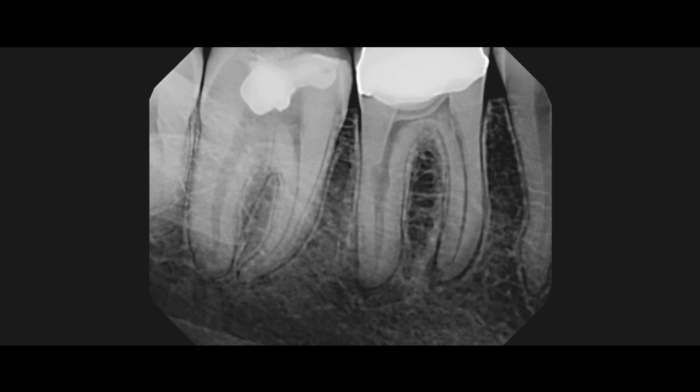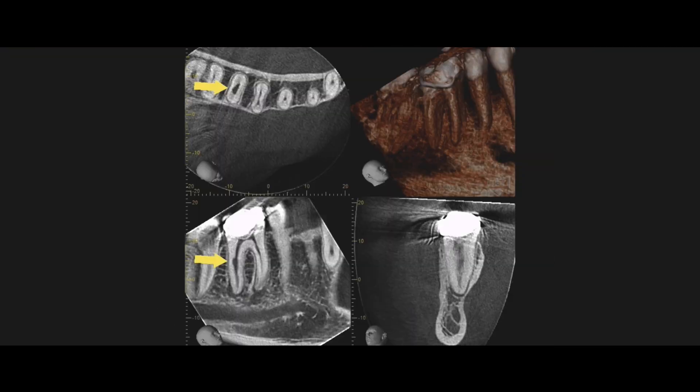The real question here is whether this internal resorptive defect is perforating or not, and that's information you can't gain from a two-dimensional radiograph. That's where the CT comes in handy. What you did next, Shervin, is you exposed a CT radiograph and took some axial sections, so you can walk us through this next slide.